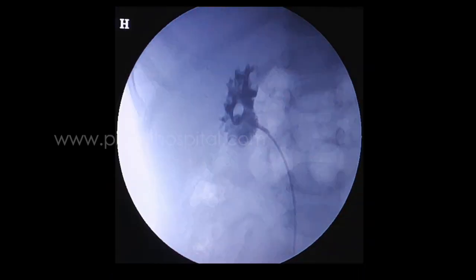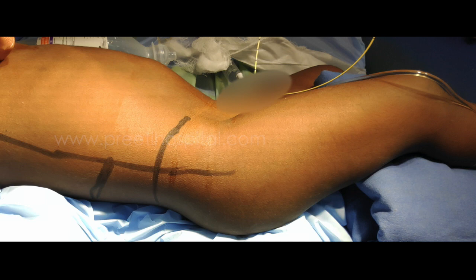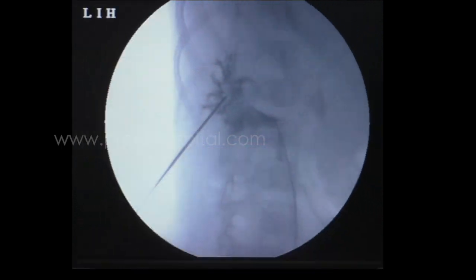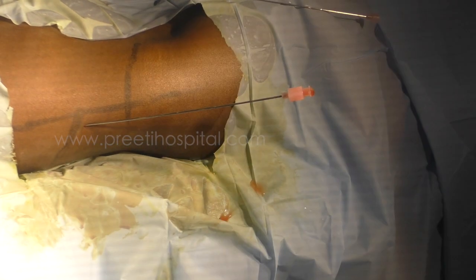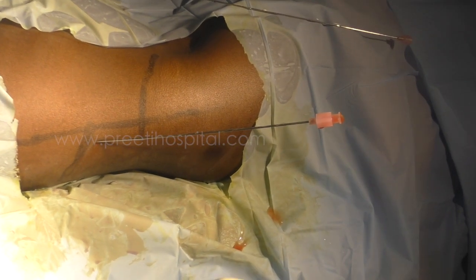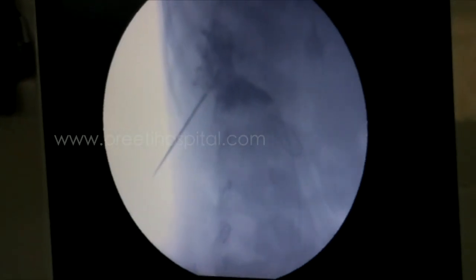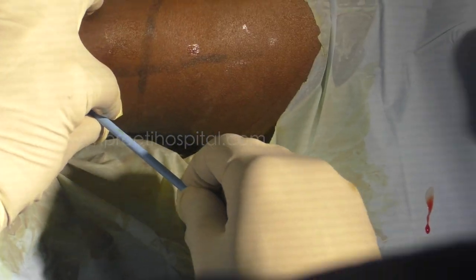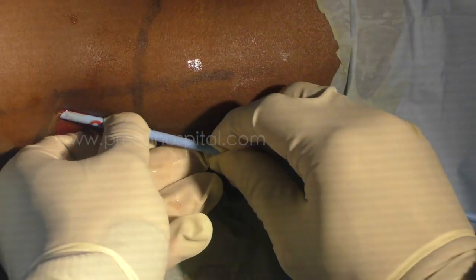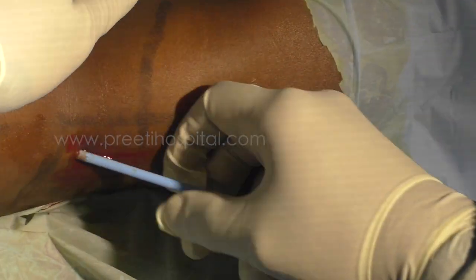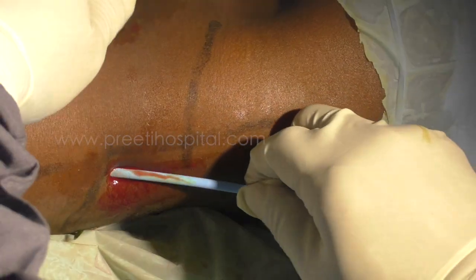We can see one stone in the pelvis. We are puncturing the middle calyx, as the inferior calyx was not getting delineated. Because the urine was clear, we proceeded with dilatation. The important thing we want to share is that during dilatation the kidney moves a lot. The dilator going inside — even with my left hand pressing heavily on the C-arm — the kidney was moving heavily. This is a major problem in supine PCNL.